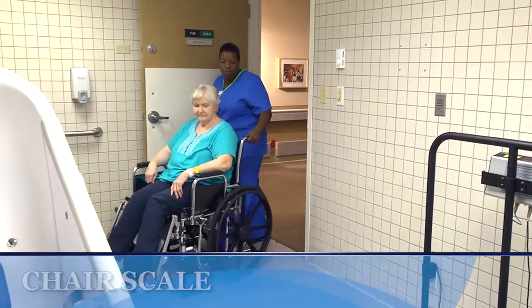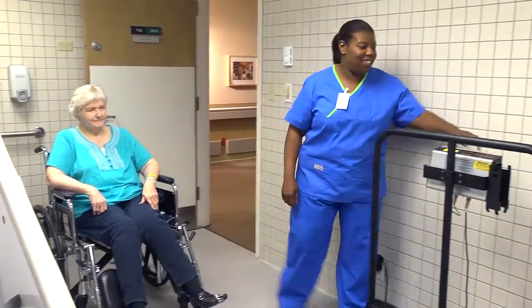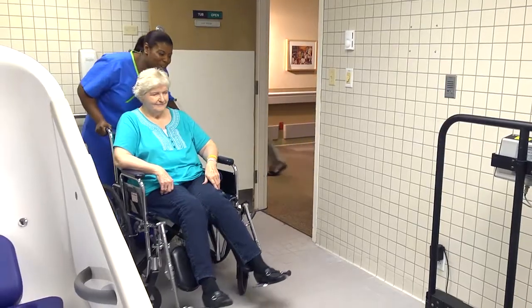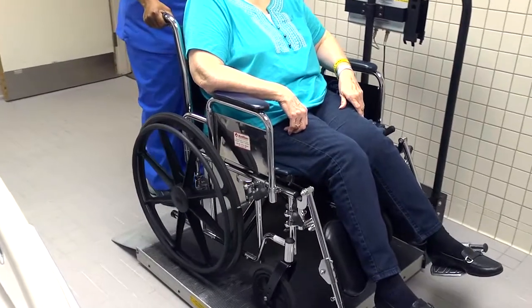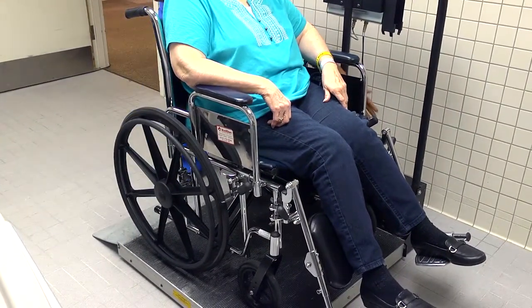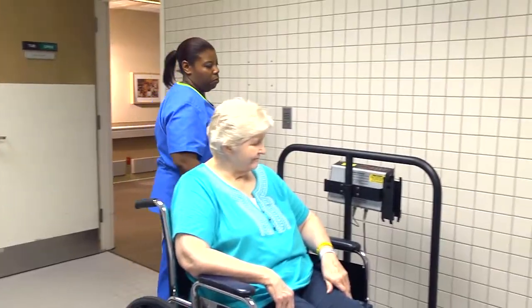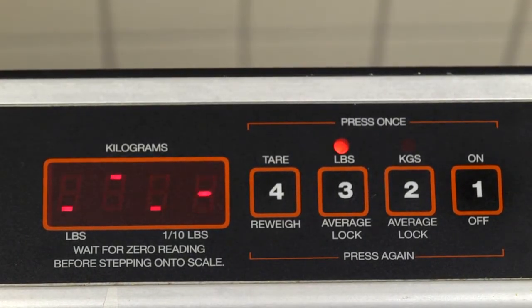If the patient is alert but unable to stand, you can roll her wheelchair right onto a platform scale. If the scale is digital, begin with a reading of zero and select the unit of measurement — on this scale, either pounds or kilograms. Position the wheelchair on the scale and lock the wheels to keep it from rolling. You'll need to have established the weight of the chair and any cushions first. For consistency, always weigh the patient in the same chair. Wait for the trigger or simply watch for the reading to appear on the digital display.